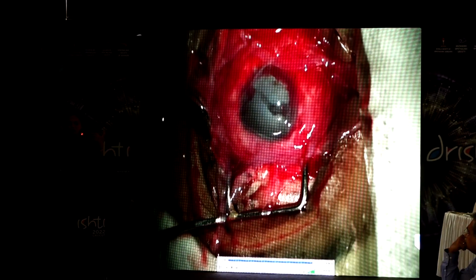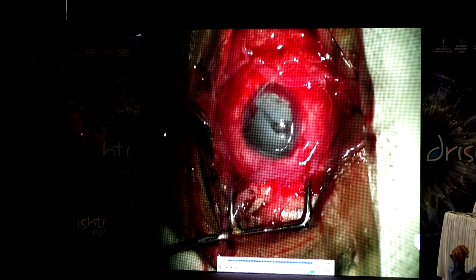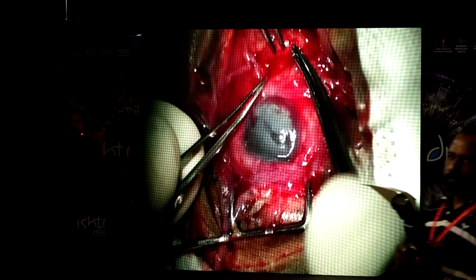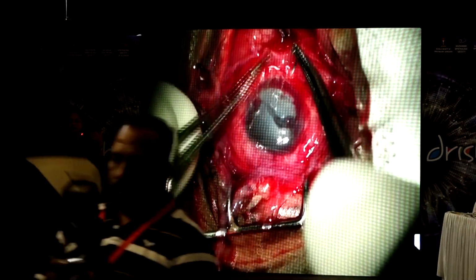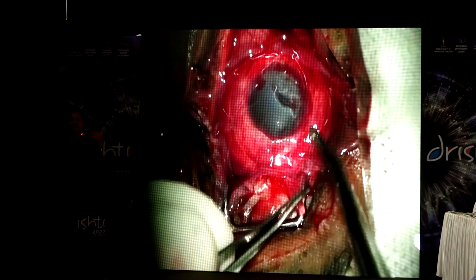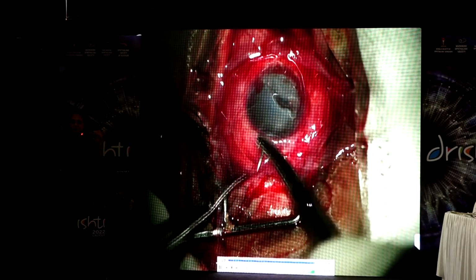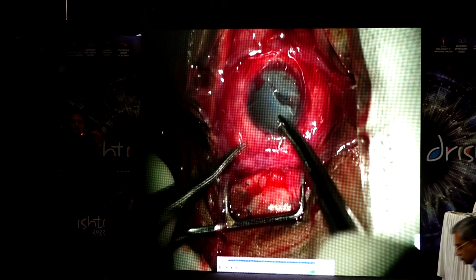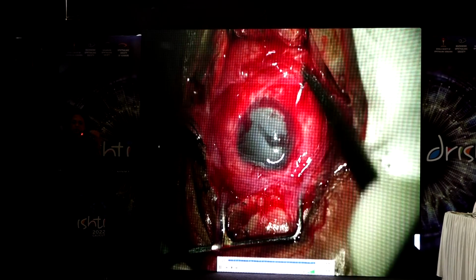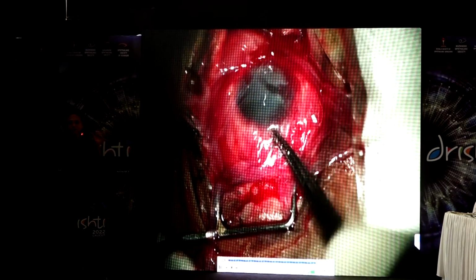The edge of this tissue is now sutured onto the inner margin of the upper lid as well. And then when you put one fornix formation suture and put in a symblepharon shell inside, that likely helps you to layer the entire membrane across the entire ocular surface. And after doing a few suture fixations, you can put your glue underneath also if you want to fixate it with an additional glue fixation.